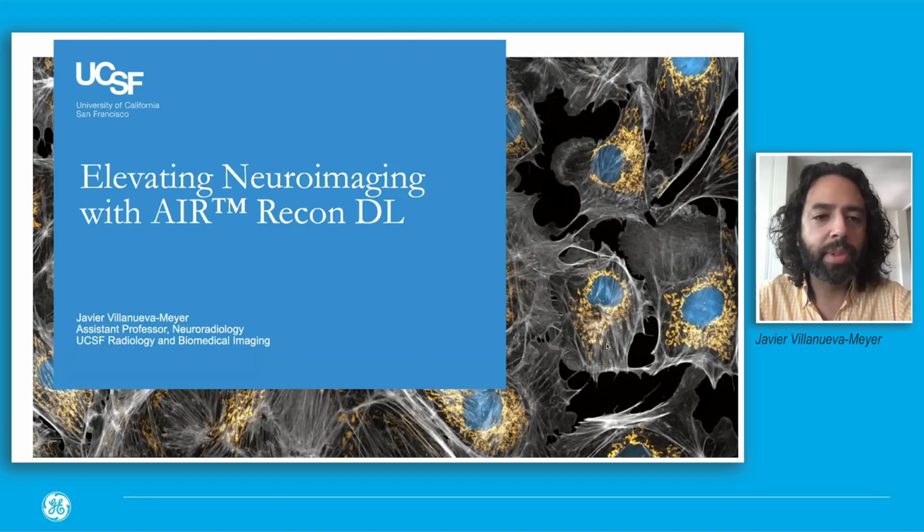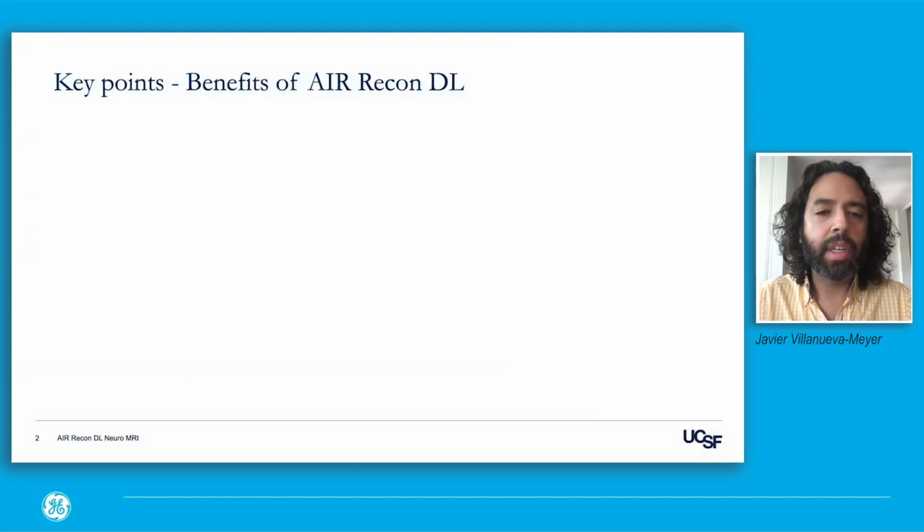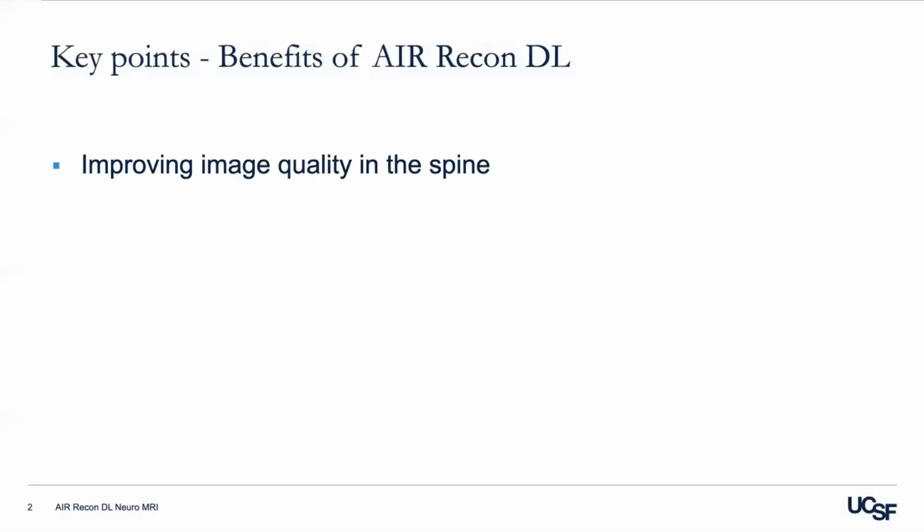Really excited to be able to share with everyone our experience at UCSF using AIR Recon DL. As mentioned, I'm Javier Villanueva-Meyer. I'm a neuroradiologist at UCSF. And today, I'll be sharing some of our experience with this new technique.